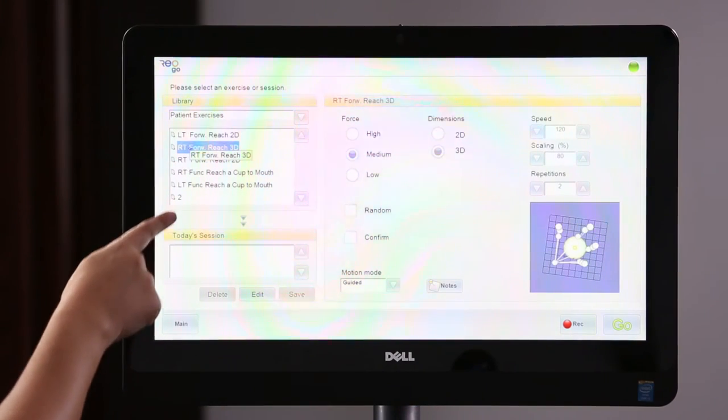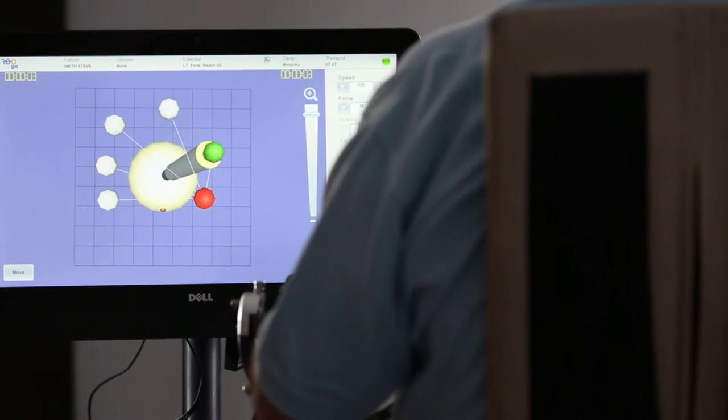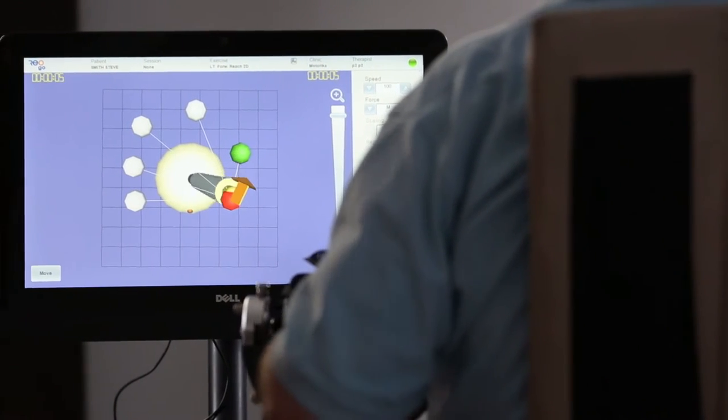The REOGO works in both 2D and 3D planes, assisting the patient to varying degrees to move their arm. The REO provides a comprehensive library of exercise patterns as well as games, engaging the patient throughout the therapy session.